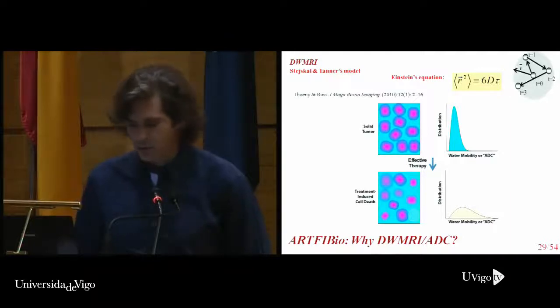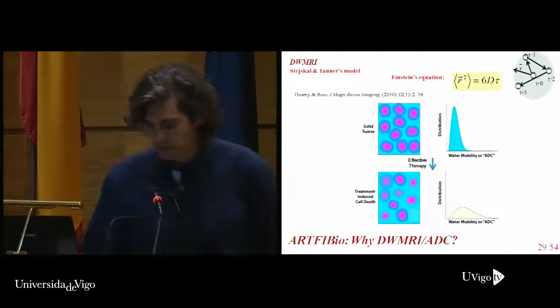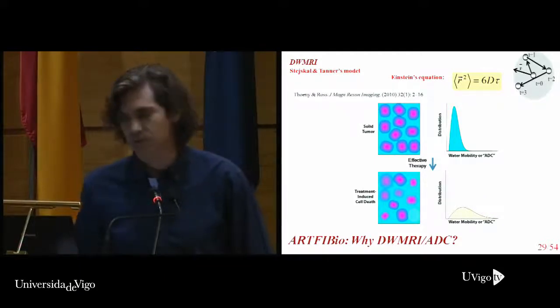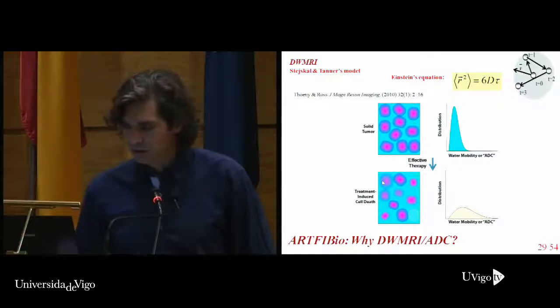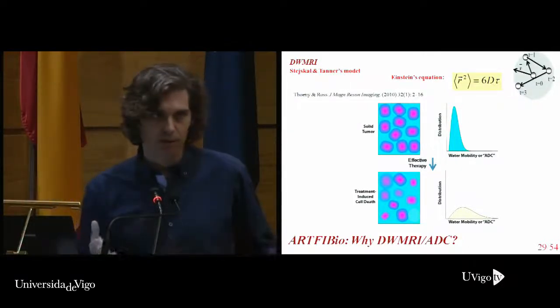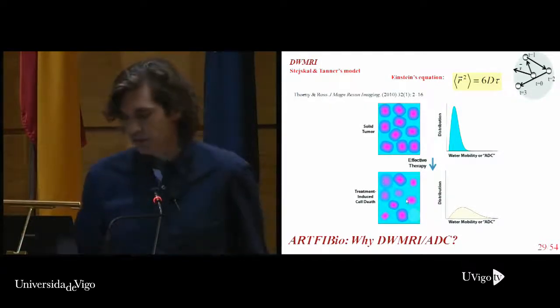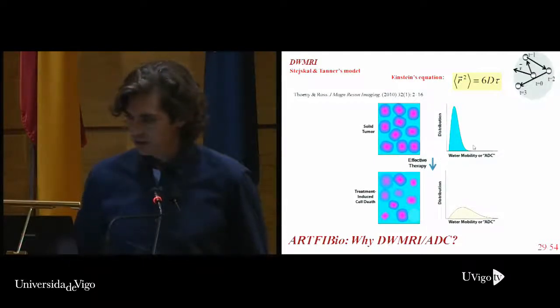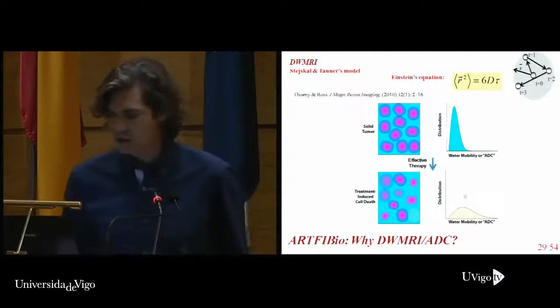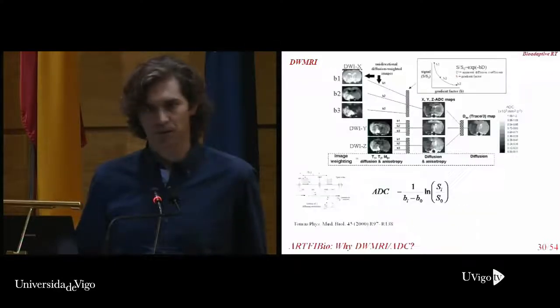The extracellular volume is smaller in the tumor region, and therefore the freedom of movement of protons in these regions is restricted. Along the treatment, when the radiation impacts the cell, the membrane is broken, and water has more freedom for moving. Then, along the treatment, we can see a shift to the right in the histogram of ADC.